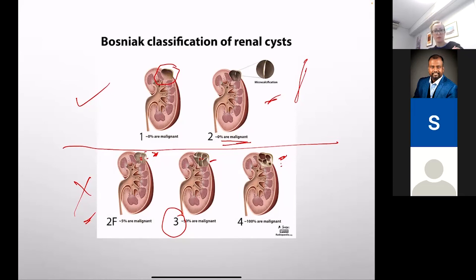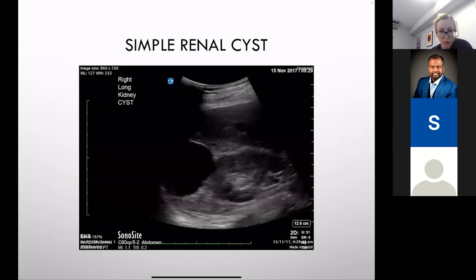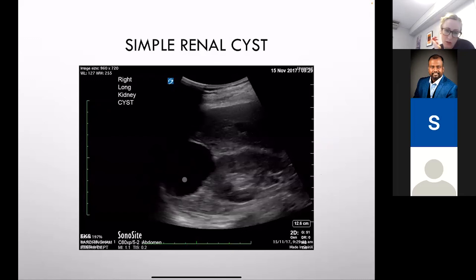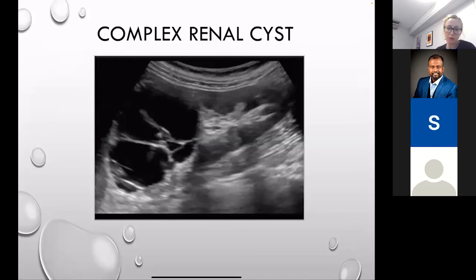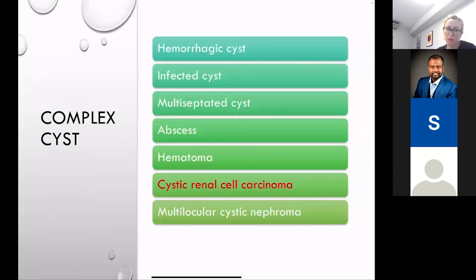A simple renal cyst is anechoic with no septations, arising from the renal cortex. A complex one has multi-septations, calcifications, nodularity on the wall — that's concerning and needs investigation. Differentials for complex cystic lesions include hemorrhagic cysts, infected cysts with pus, abscesses, hematomas, and renal cell carcinoma. Polycystic kidneys — you'll see it and immediately recognize it, particularly with chronic renal failure and hemodialysis patients.